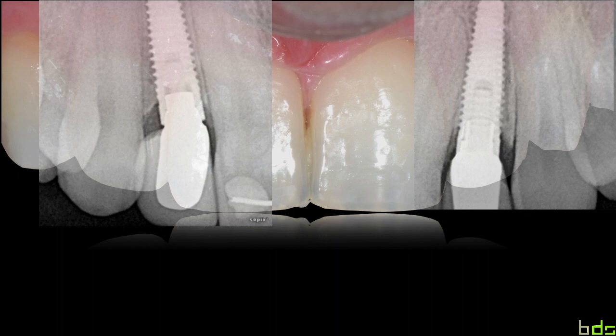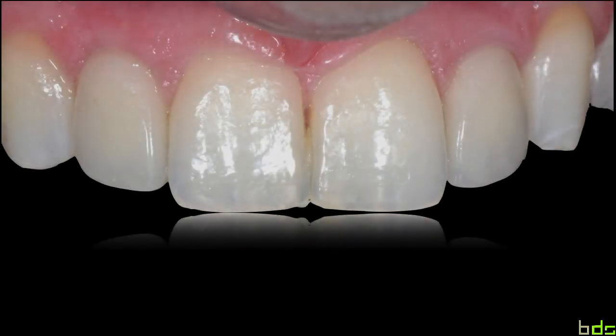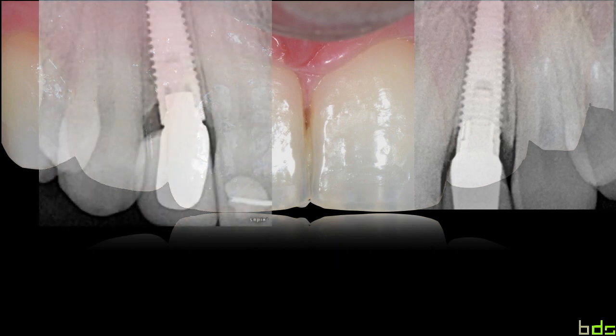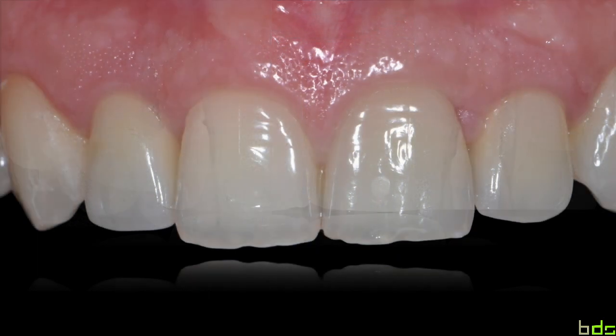However, clinically, how relevant is that? Go back to the clinical photo. We have a very impeccable result with great white and pink aesthetic scores. So what is the effect of the macrogeometry on the clinical level?